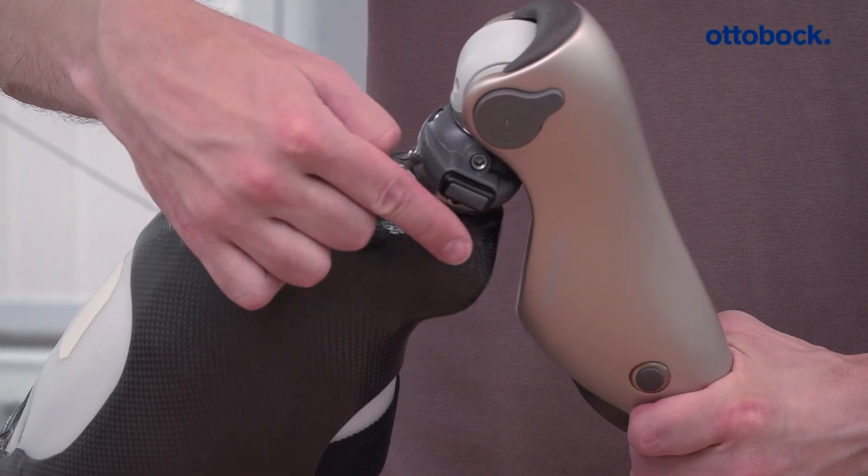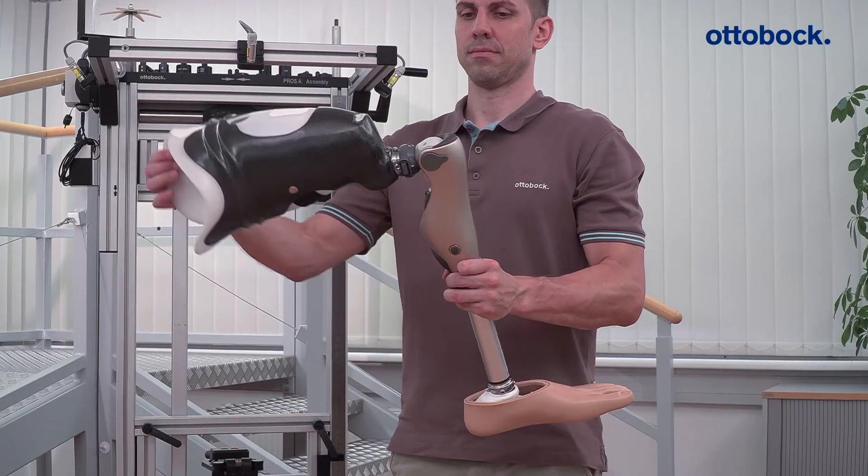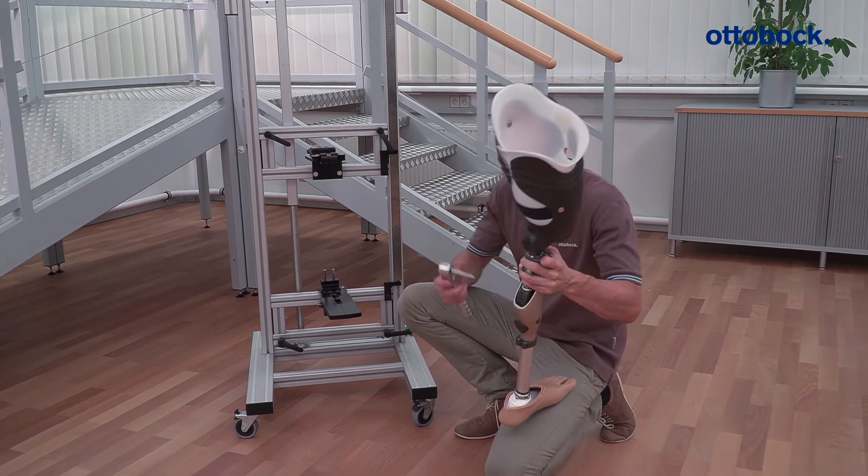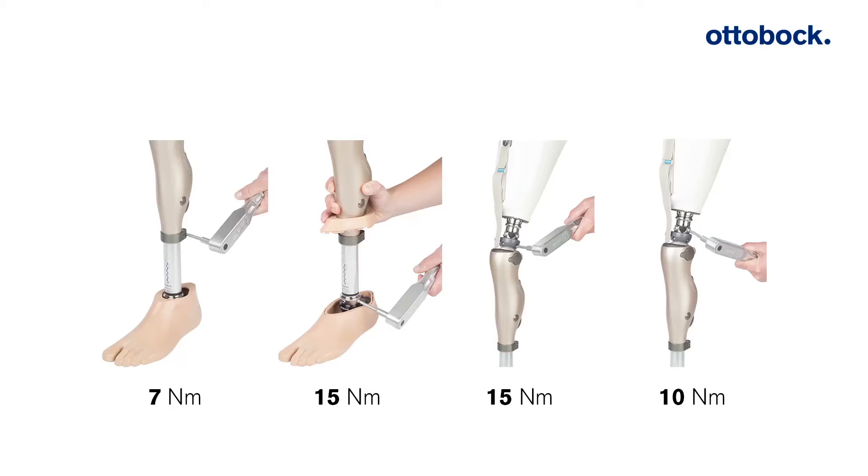Also make sure there is space between the socket and the head of the knee when the joint is at its maximum extension. Then tighten all screws to the specified torque.